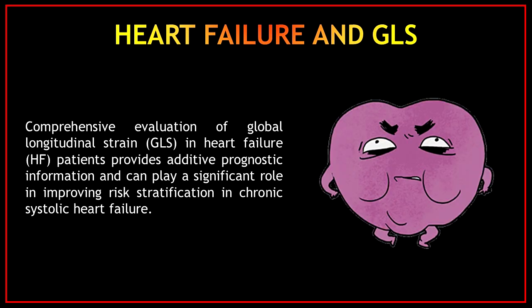Comprehensive evaluation of global longitudinal strain in heart failure patients provides additive prognostic information and can play a significant role in improving risk stratification in chronic systolic heart failure.